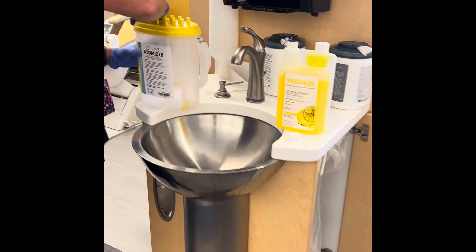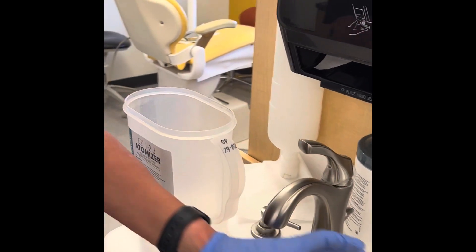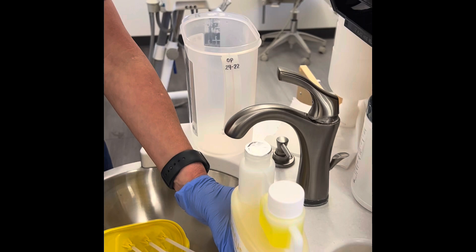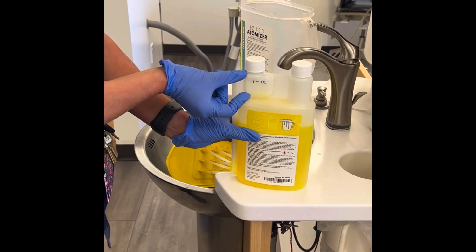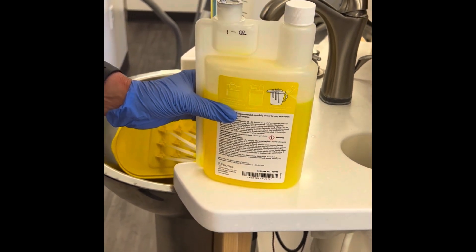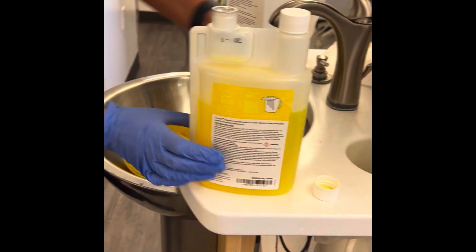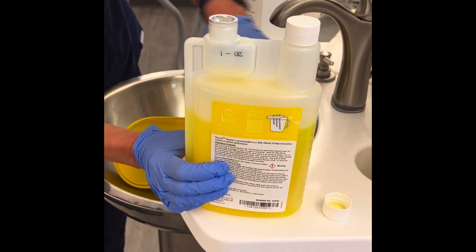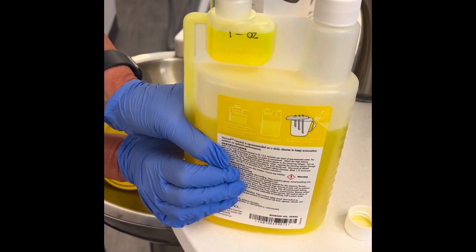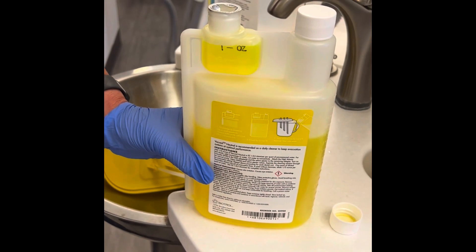When you take it out, you open it up. You use the VacuSol cap with the white square ounce marker. Carefully, you squeeze the bottle and you will see the water accumulating on the top. When you reach the one ounce mark, that's exactly what you need for two chairs.